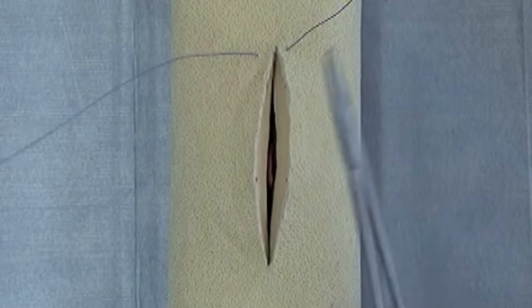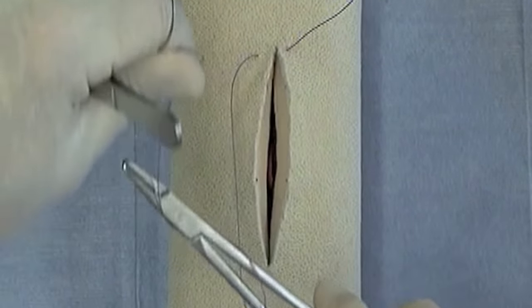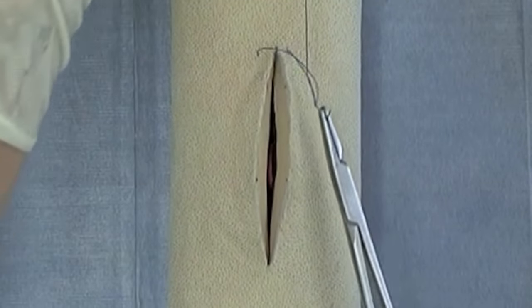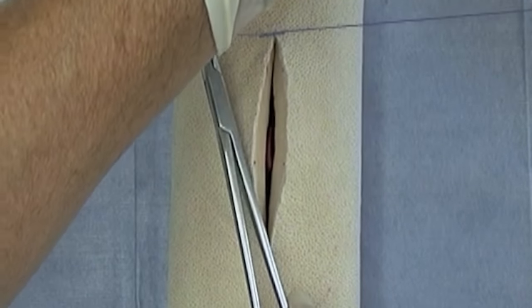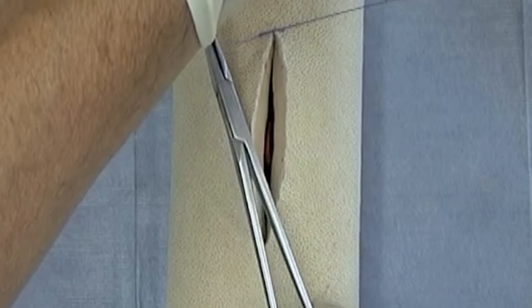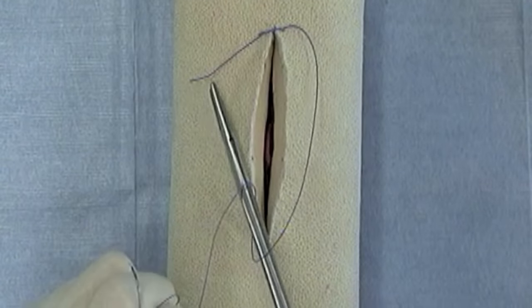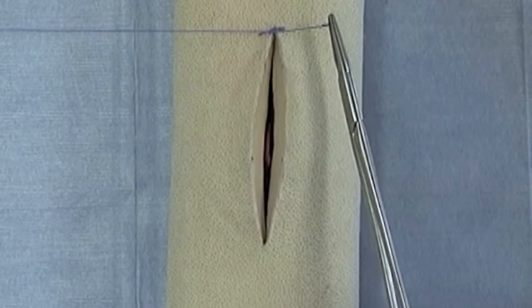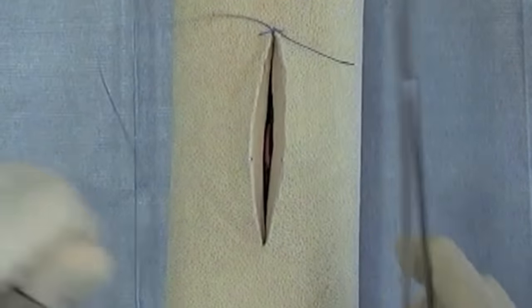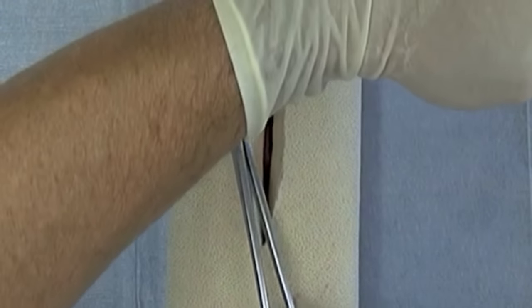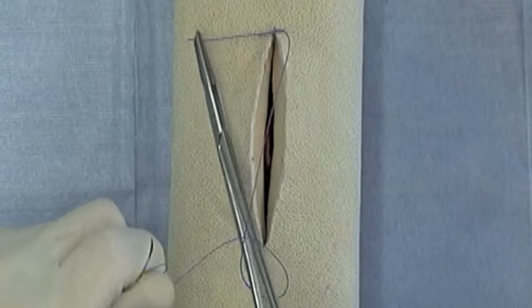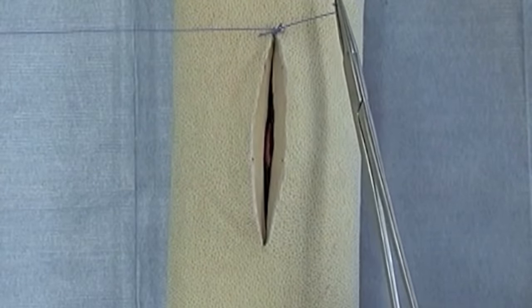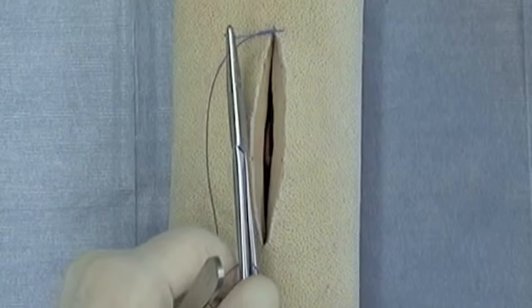Now with polyglactin 910, I don't have a lot of friction, so I'm going to use a surgeon's knot and hopefully that will be enough to maintain the tension that I want across this suture line. I put a surgeon's knot followed by two additional throws.